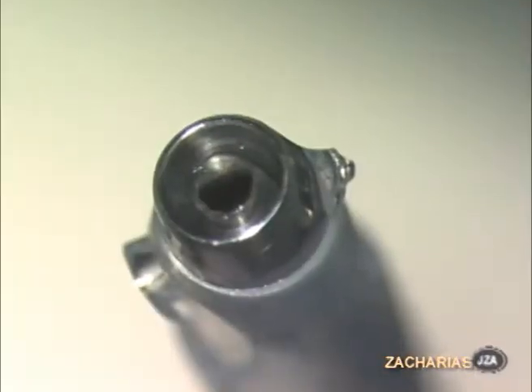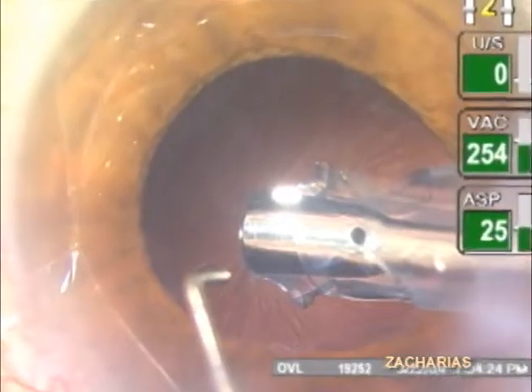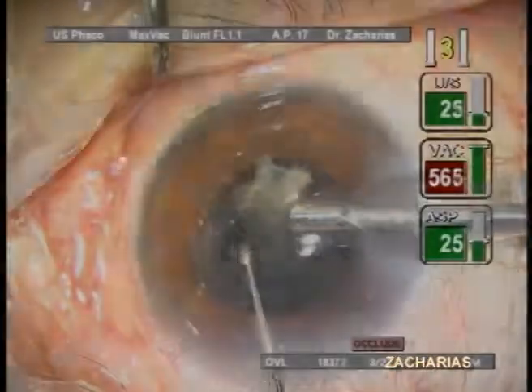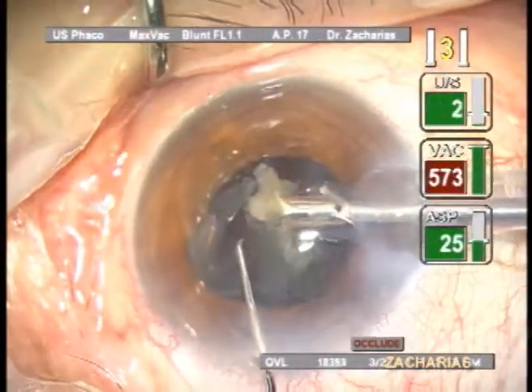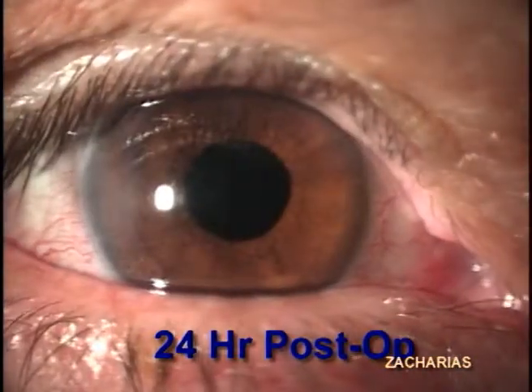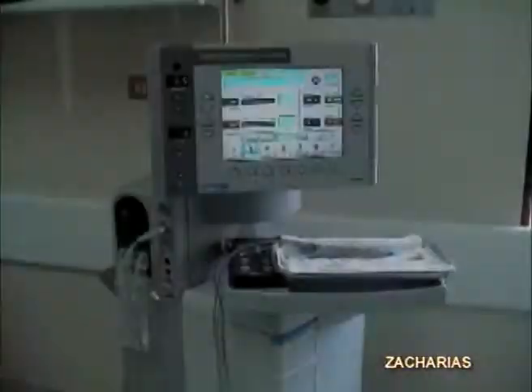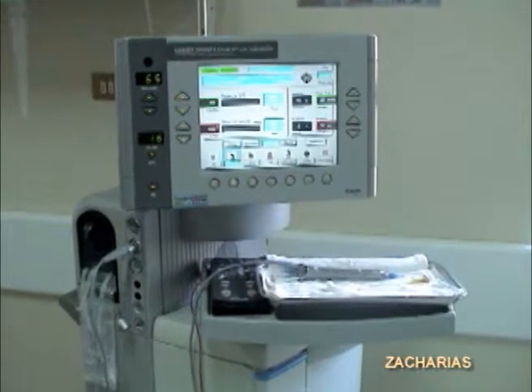We strongly believe that an elastomer-capped, blunt phaco tip provides maximum capsule protection, while being at least as effective as any of the currently promoted non-ultrasound-based lens-removing methodologies. Also to consider, this soft-tip phaco probe concept uses the installed base of ultrasonic phaco consoles without any modifications.